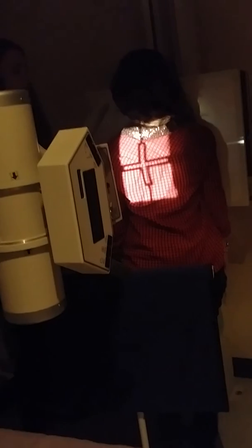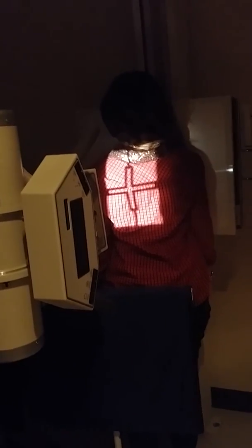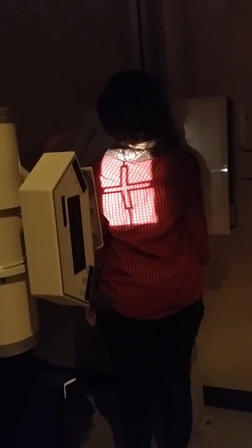Then you'll just mark it. It's really hard to see — some people you might get a little bit of light above the shoulder, but most people you won't see it. I'm just going to mark the left side. She can do shallow breathing on this to blur the lung markings out, or you can just have her hold her breath. And that's it for the RAO.